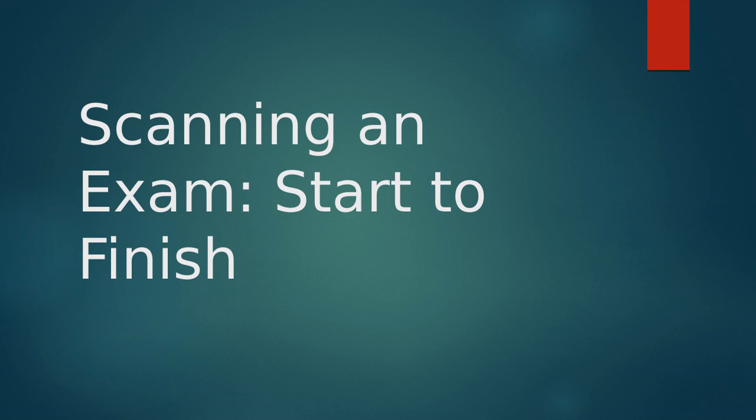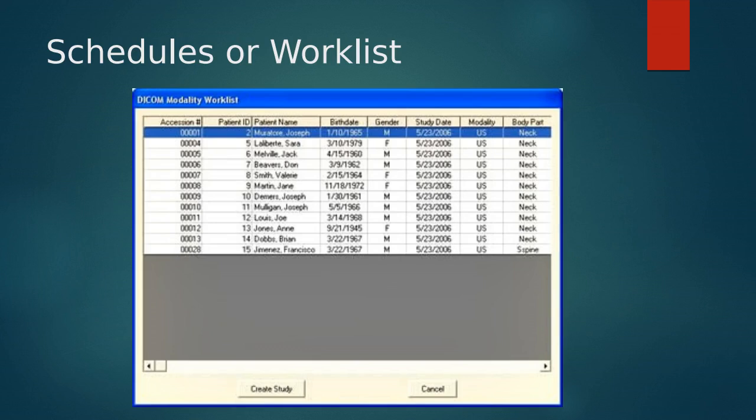So we have talked a little bit about some of those basic controls in lab up until this point, but we're definitely going to be taking them a step further, and I will start to expect you guys to be aware of these controls when we are in lab from here on out. So we're going to be starting with how we perform our exam and some of those major steps.